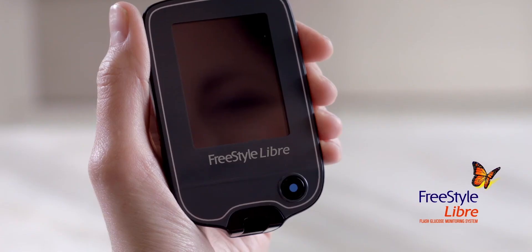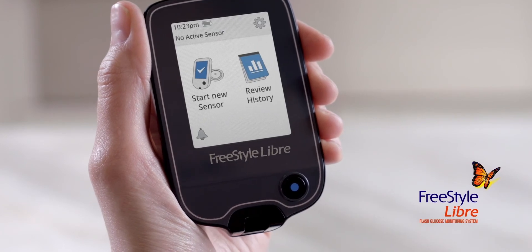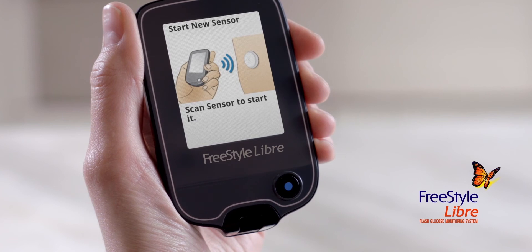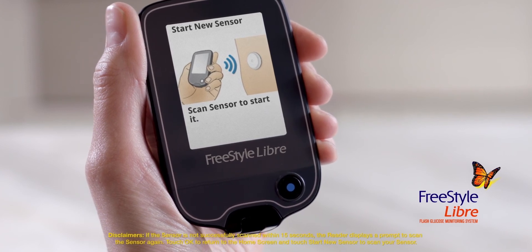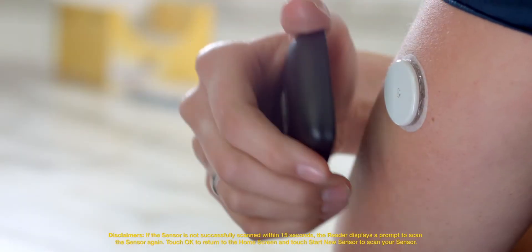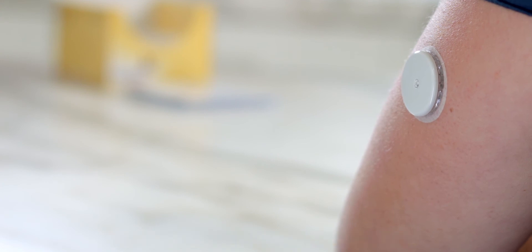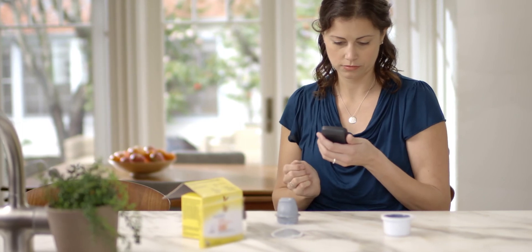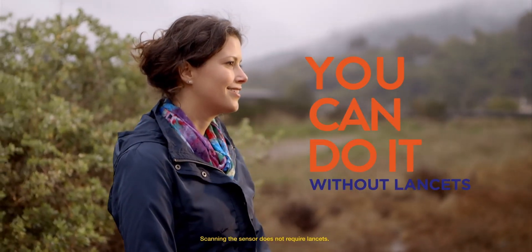All that's left is to start the sensor. Just press the blue home button to turn on your reader. Tap 'Start new sensor' on the screen. An image of a hand holding the reader next to a sensor on the arm will appear. Hold the reader within 4cm of the sensor to scan it. If sounds are turned on, the reader beeps when the sensor has been successfully activated. Helen can get her first glucose reading in an hour. Why prick when you can scan? Stay tuned.